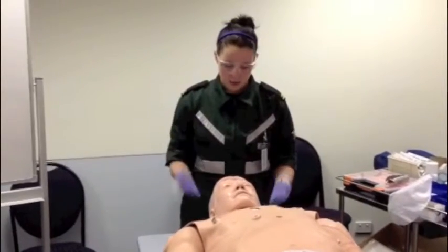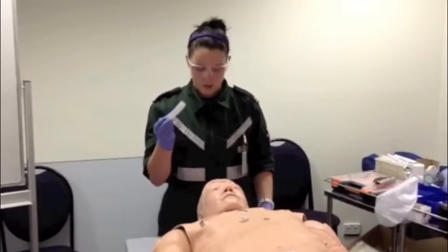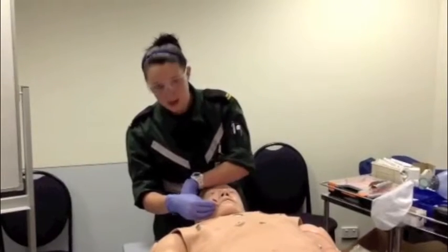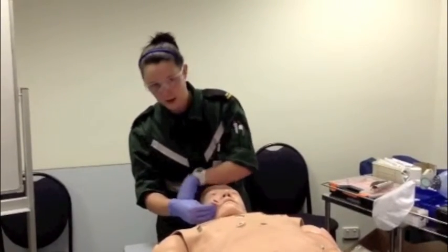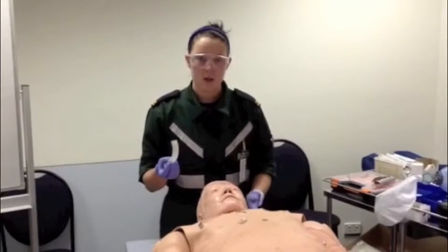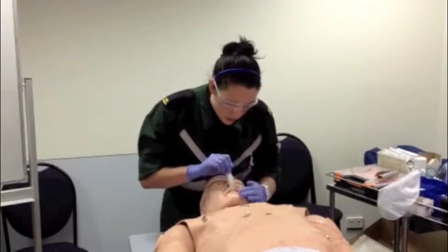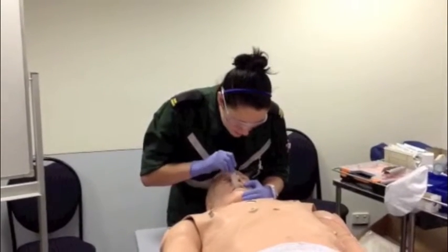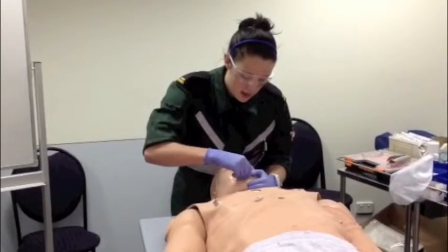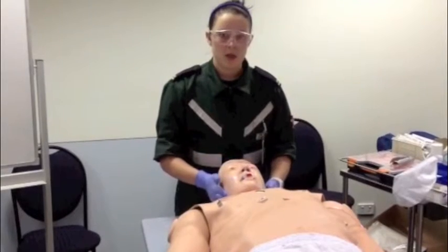Oropharyngeal airway. The patient has already got support from the previous skills. To start, you measure the correct size by measuring from the corner of the mouth to the temporomandibular joint just below the earlobe. First, you lubricate the OPA with either the patient's saliva or some water. You start to insert the OPA towards the patient's palate, and once you're halfway in, you rotate 180 degrees until the OPA is resting nicely against the patient's lips.